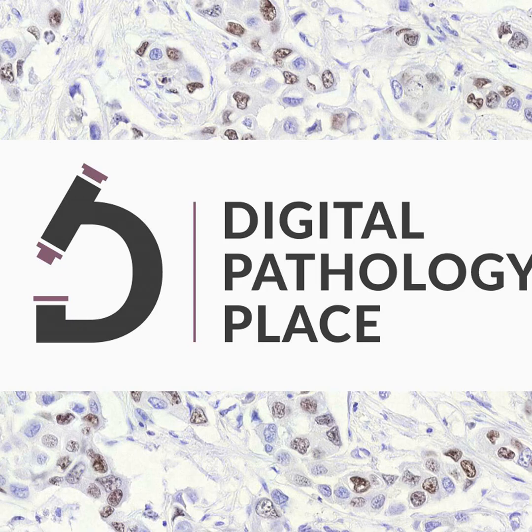and that you have made those divisions very carefully, in that if you've got multiple images from the same patient, they're not spread across the sets. They're in one of those. And maybe even if you've got data from different medical centers, maybe those all should be in only one of those sets instead of spread across them as well, because that will allow you to evaluate how well your model does on a medical center that is different than the one you trained on. So those are very key in order to set up model training and in order to evaluate how well you're doing.